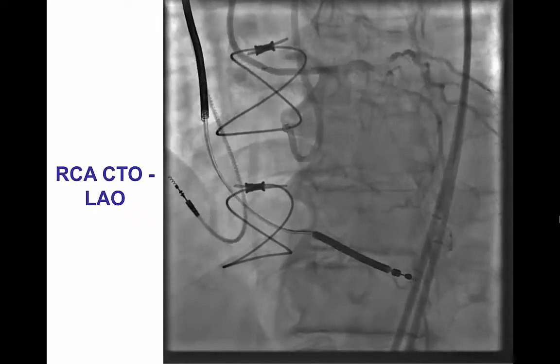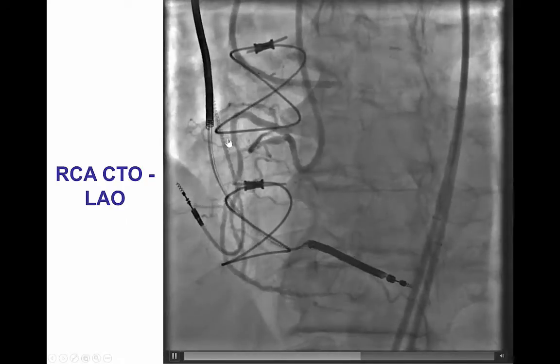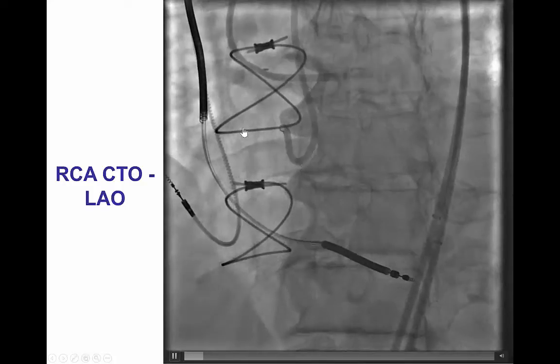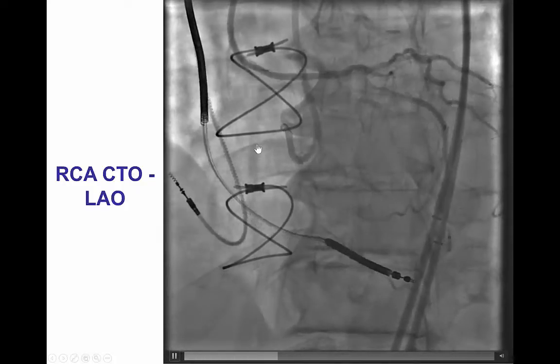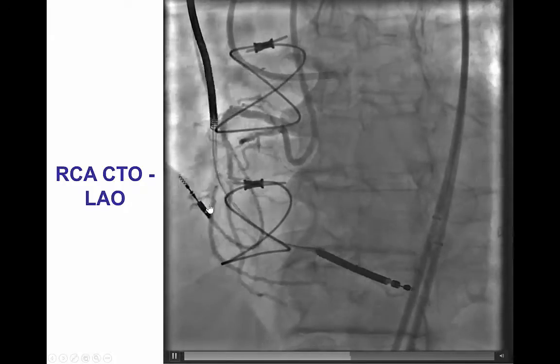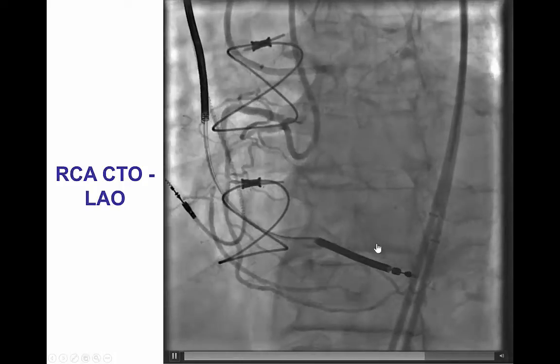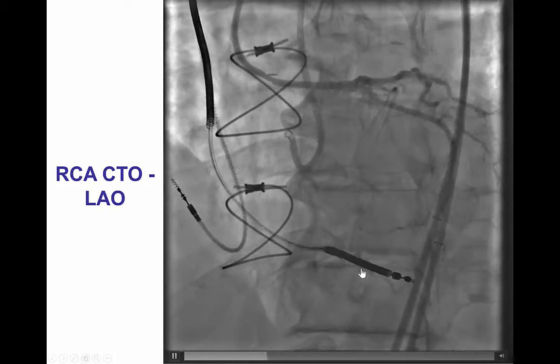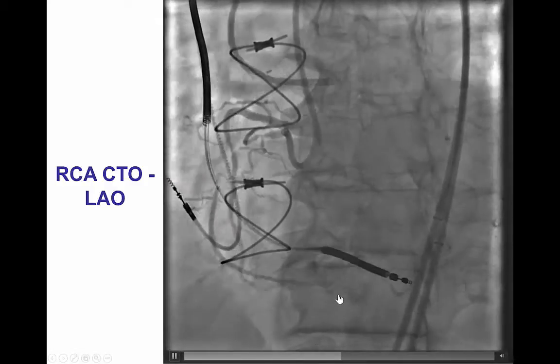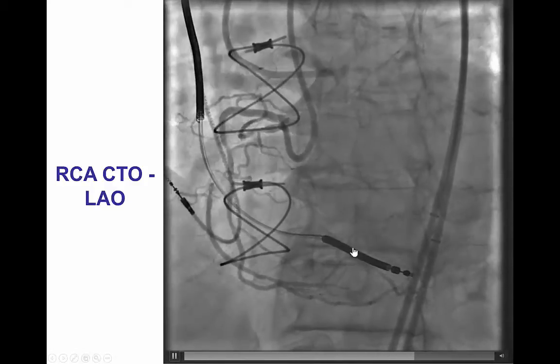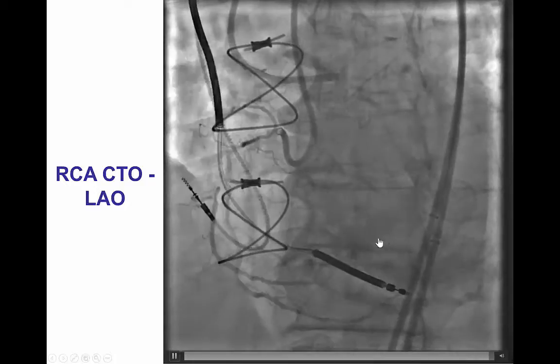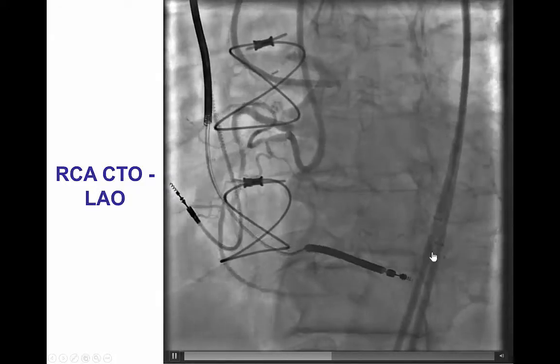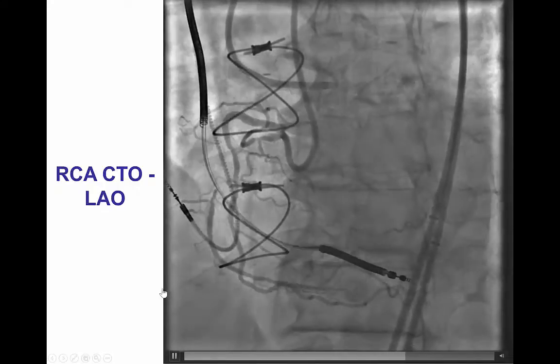The patient had a mid-right coronary artery CTO. There was an acute marginal branch originating at the proximal cap. The lesion length was about 40 mm, and there was a good quality distal vessel, although very distally the size of the vessel was fairly small. The posterolateral was filling via an epicardial collateral, which was tortuous and of small caliber, and it was unclear if the septal collaterals did reach all the way to the very small PDA.